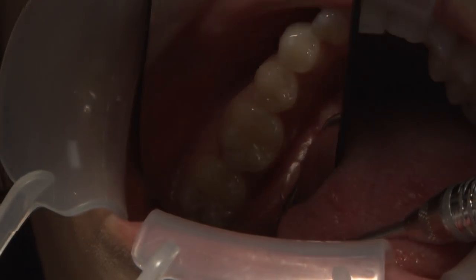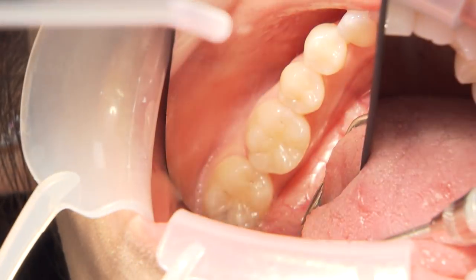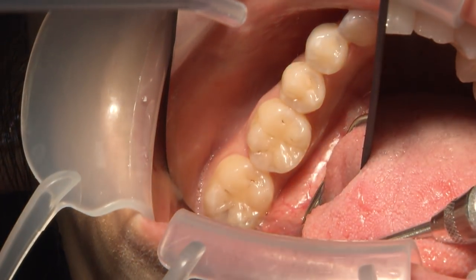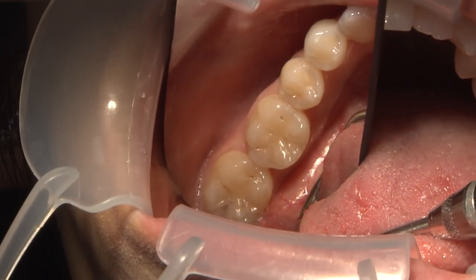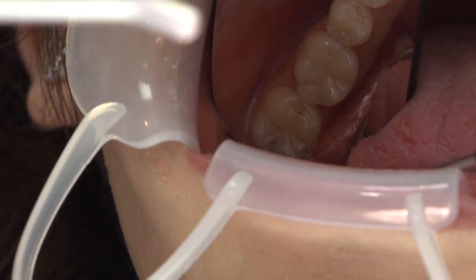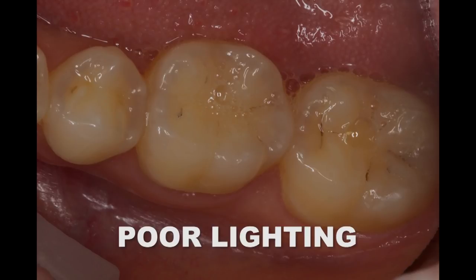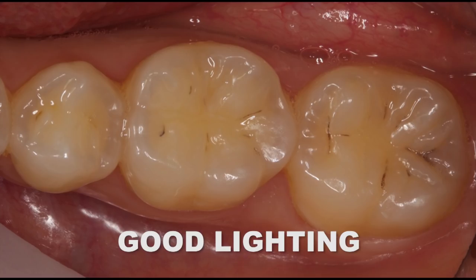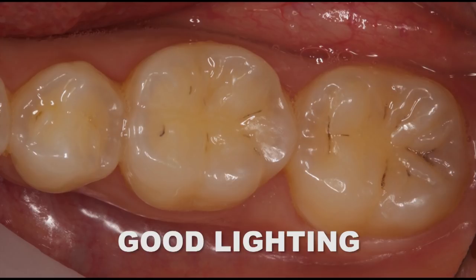Posterior shots may or may not need additional lighting depending on the quality of illumination from the camera flash. Test a couple images with and without additional outside light sources involved to find what works best in each particular situation. Pay close attention to the focus of the external light beam and adjust accordingly to determine if light reflected off the mirror, direct illumination, or no external lighting at all will work the best.